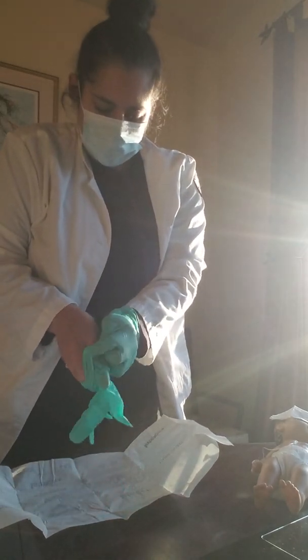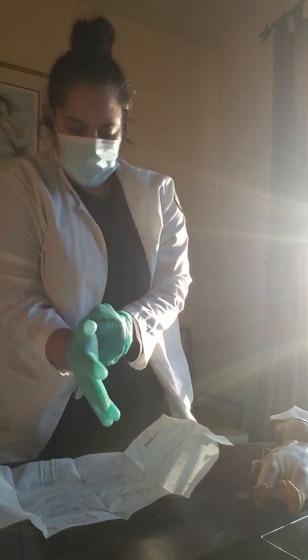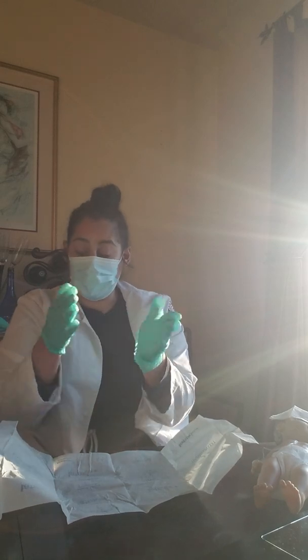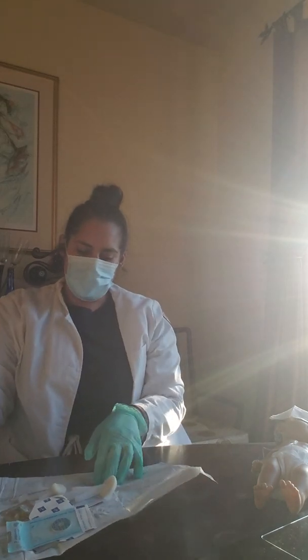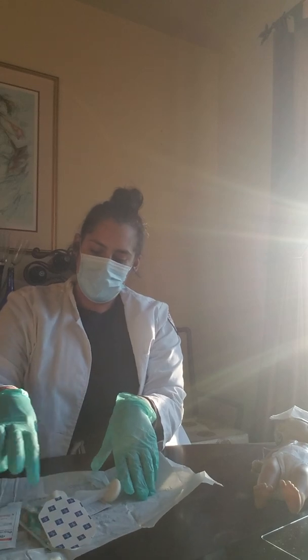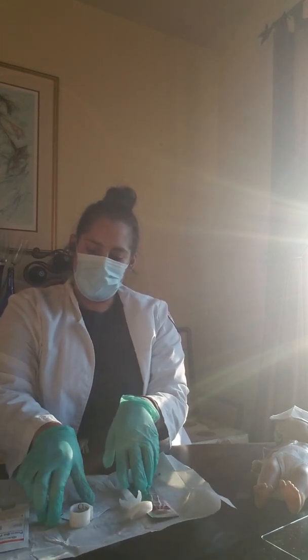I want to stand so that way you guys can see it's below my waist, but I'm just kind of pretending at this height that it's below my waist, or it's above my waist, sorry. Okay, and then I'm just going to kind of dump my supplies. And just bear with me while I get set up really quick. I kind of like to just put it in an order.